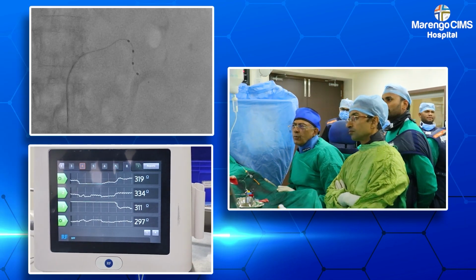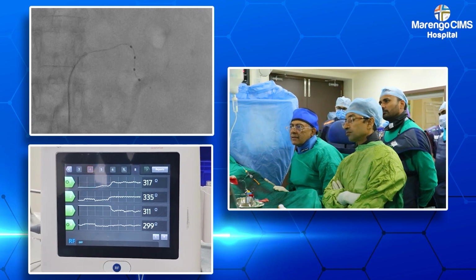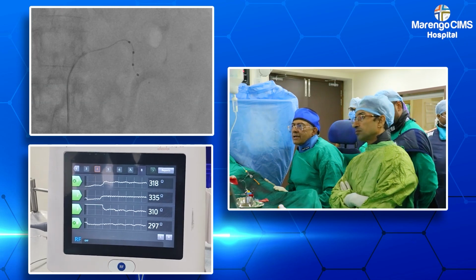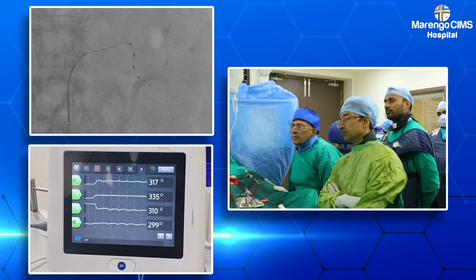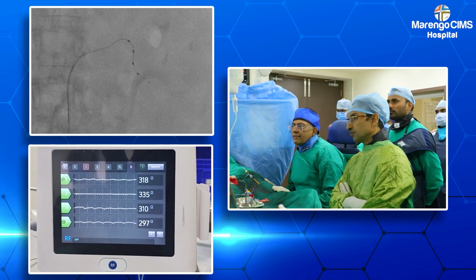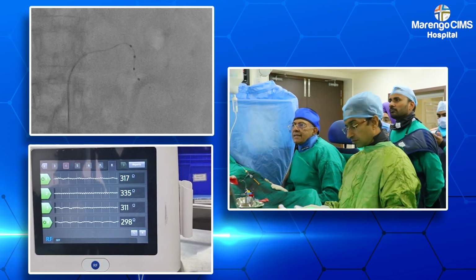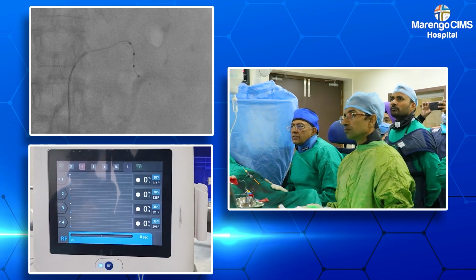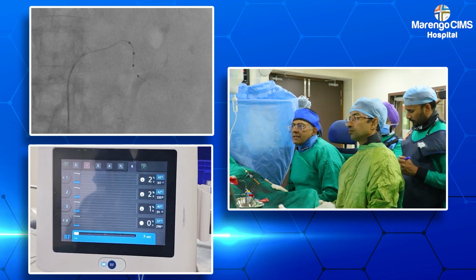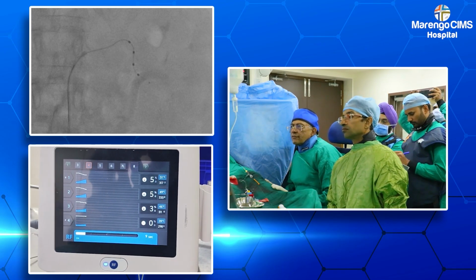We pull a little bit of the catheter. Ideally we should pull and push using the wire, but judicious pull back in a not heavily angulated and not abnormal anatomy, 2-3 millimeter pullback is adequate, but never push. So Dr. Vipul can now ablate all 4 points, 3 inside the inferior branch of the renal artery, the middle branch, and 1 inside right proximal to the carina with at least 4 millimeter margin from the carina.